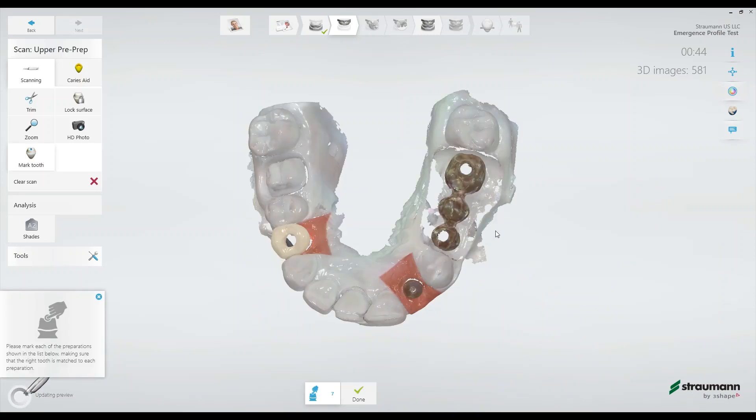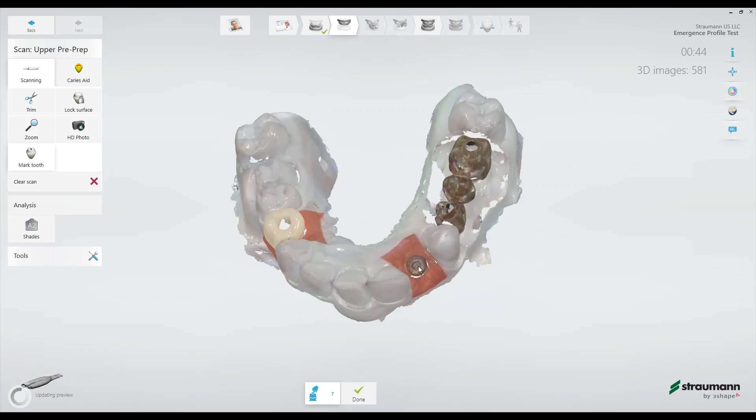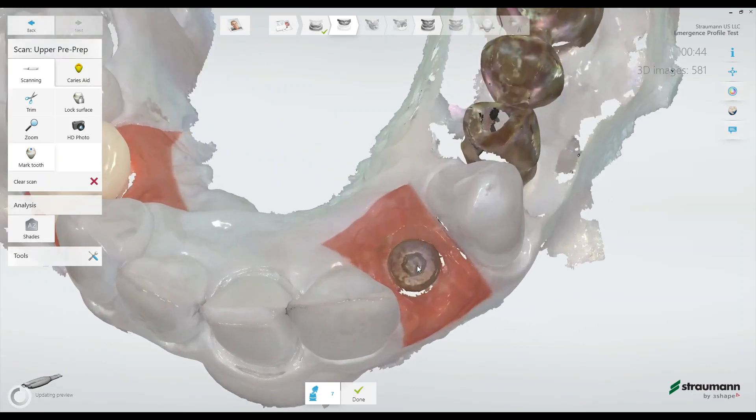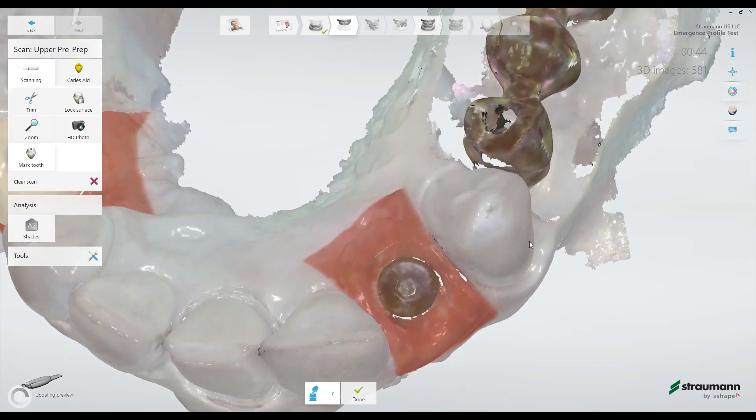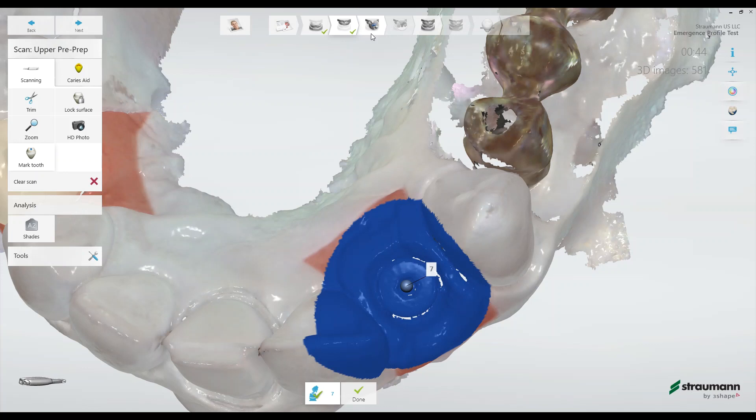At this point, the scanner will ask me to identify tooth number 7. It's important to do this from an occlusal view. By indicating position number 7, the scanner will automatically cut out this blue zone when it pulls all of the rest of the scan data to the next scan page, where we'll scan in the emergence profile, and then the next scan page, where we'll scan in the scan body.